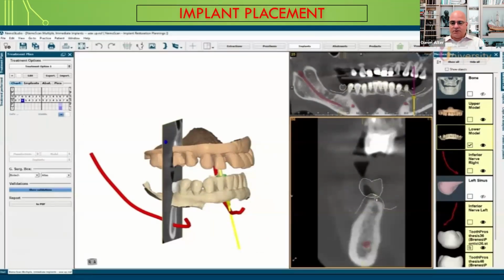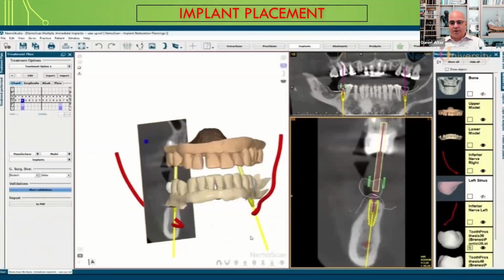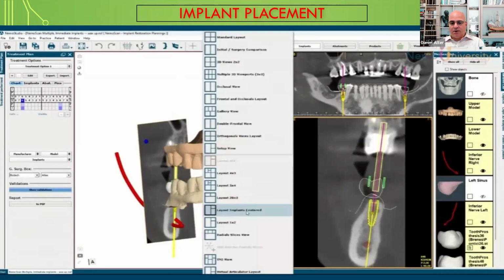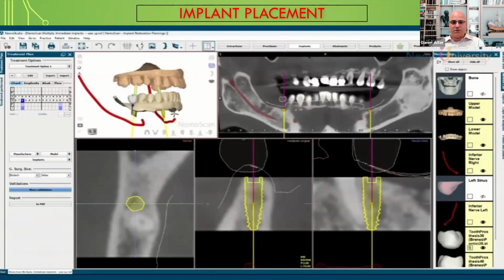So if you're restoring the lower, or the mandibular, the lingual cusp, or the non-working cusp, is where your access hole should end up. If you're doing the maxilla, it will be the opposite. But one thing that you also want to make sure is that no function occurs on the access holes, meaning that those access holes are oftentimes the weakest point in the biomechanical system of the material.